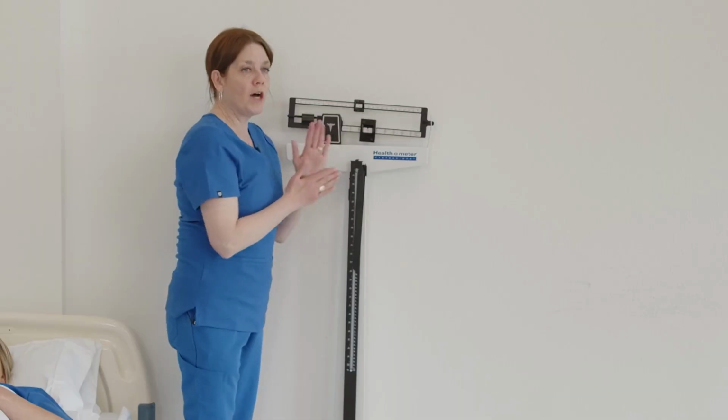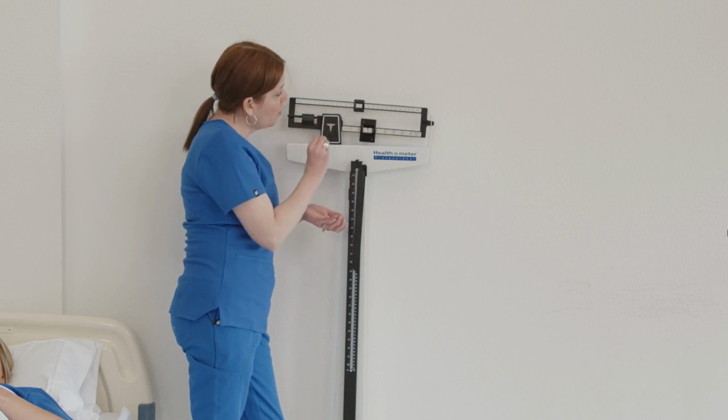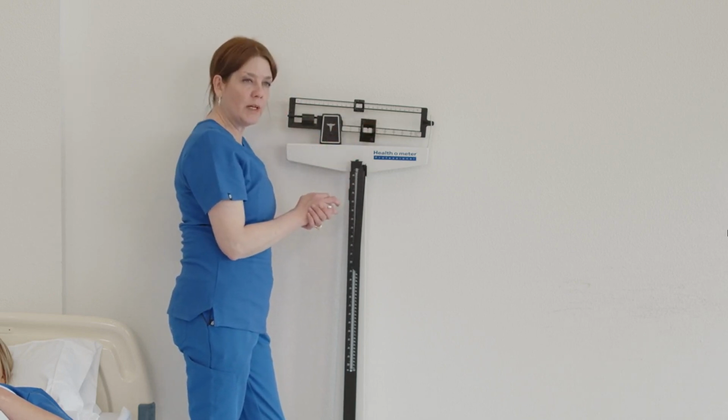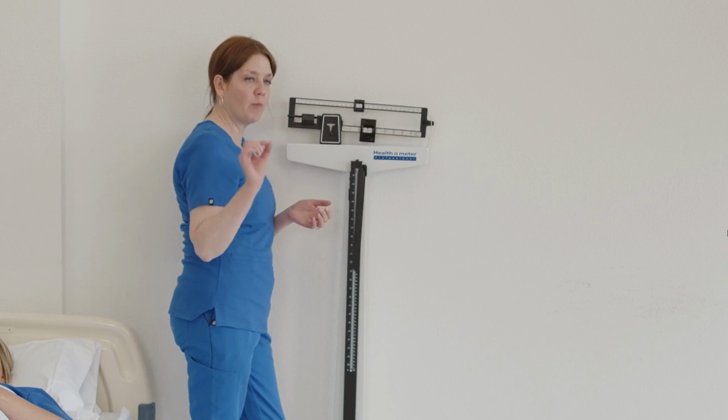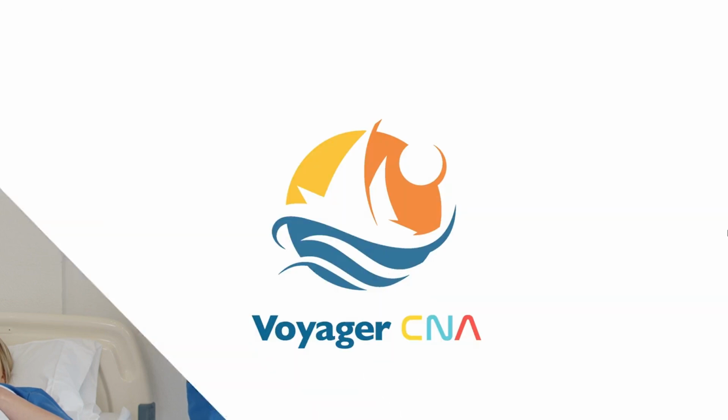And then wash my hands again and skill complete. We always wash before we record. So wash, record 126. We'll abbreviate that as lbs for pounds. And then wash my hands again and say skill complete.